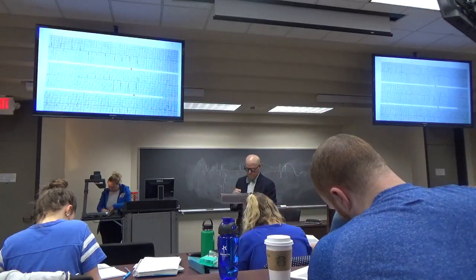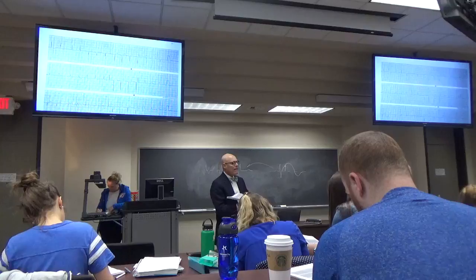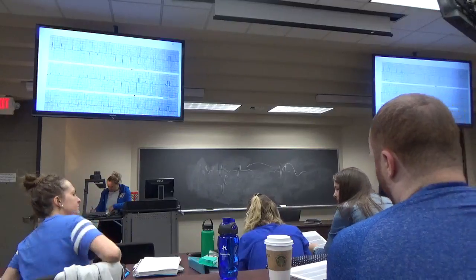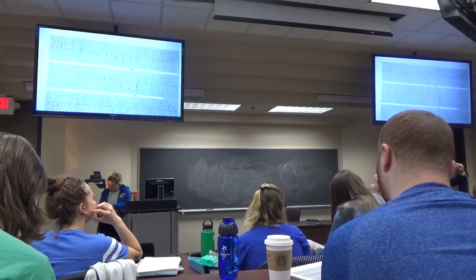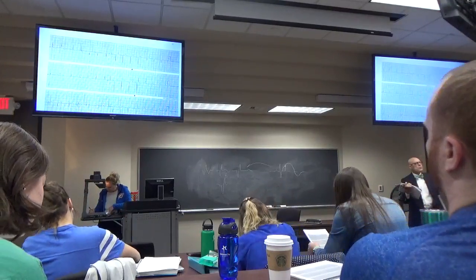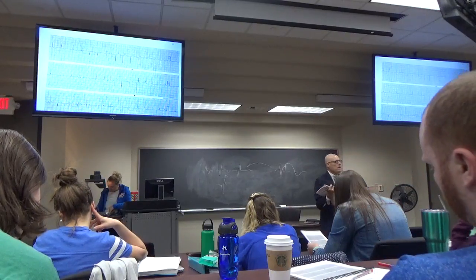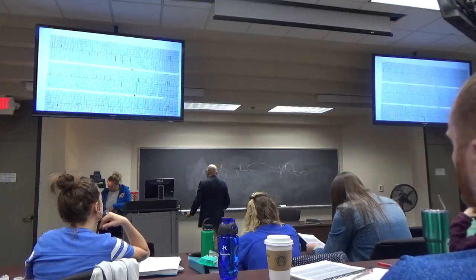If you have the deep S wave in V2 and the biphasic P wave in V1, would it show left atrial enlargement? Yeah, so if you're going to use the P wave in V1 to count towards LVH, then by definition it is left atrial enlargement. Remember that the criteria is the same.